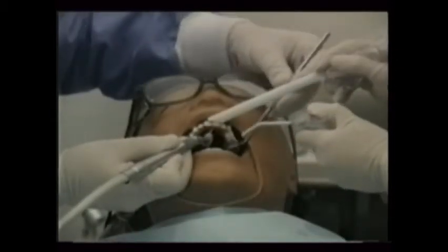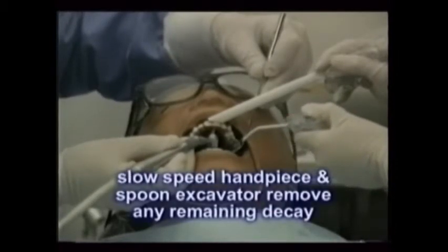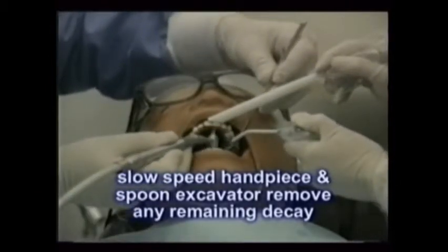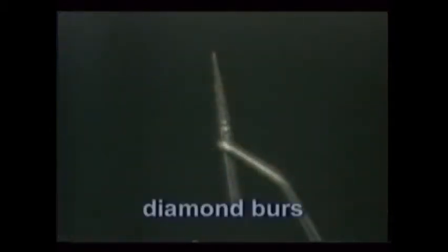A lot of the tooth preparation in placing composite fillings is done with the high-speed handpiece and dental burrs. A slow-speed handpiece or spoon excavator is used to remove decay or fine-tune the preparation. Diamond-impregnated burrs leave a roughness that some dentists like because it enhances the bond of the filling to the tooth.